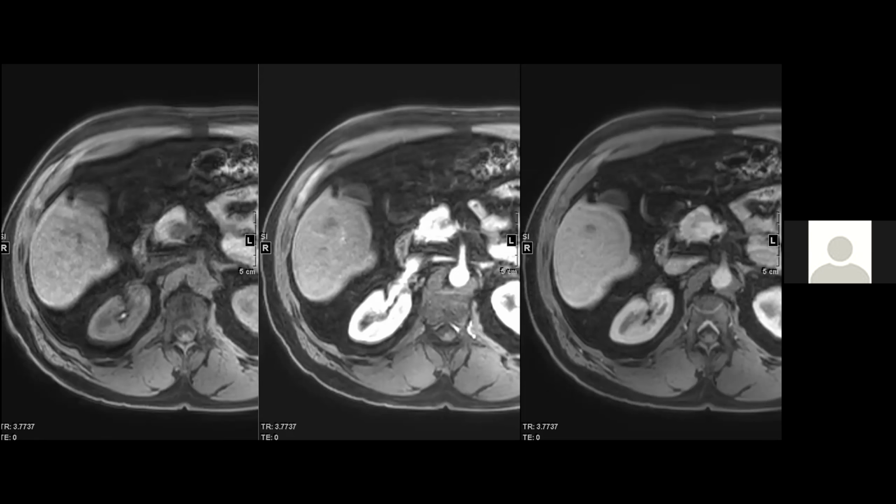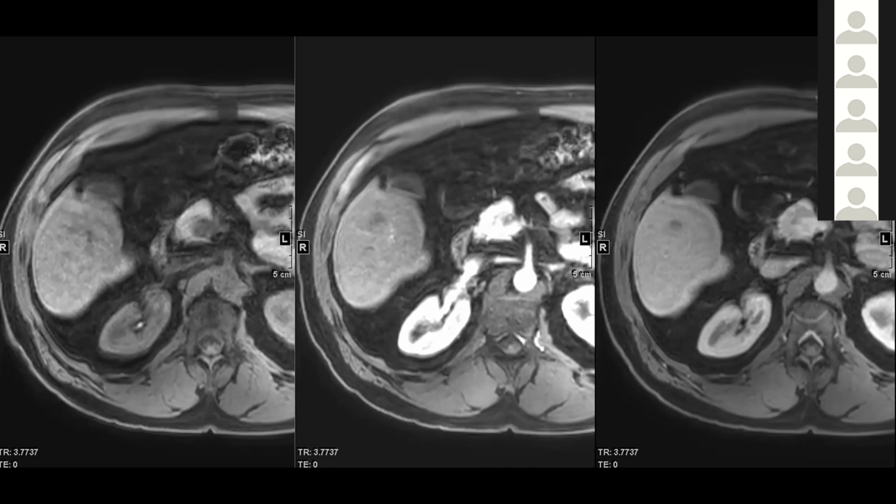Right. So fabulous question, and we actually spent an hour and a half, I'm not kidding, that's why I was late to the call, having a discussion with the LI-RADS steering committee of whether this particular thing, where you have hypo to more hypo, is truly washout. It was an interesting and lively discussion. Technically, as the definition in LI-RADS stands right now in version 2018, you have to have isointensity at least on arterial phase to call something washout. So if you want to be very precise, you would not call it washout appearance based on the current definition, but that may change.